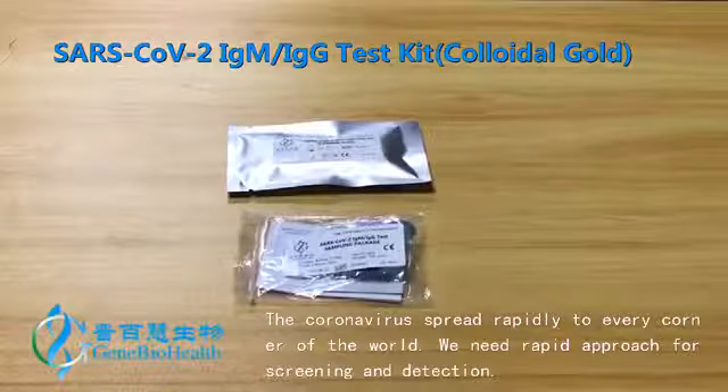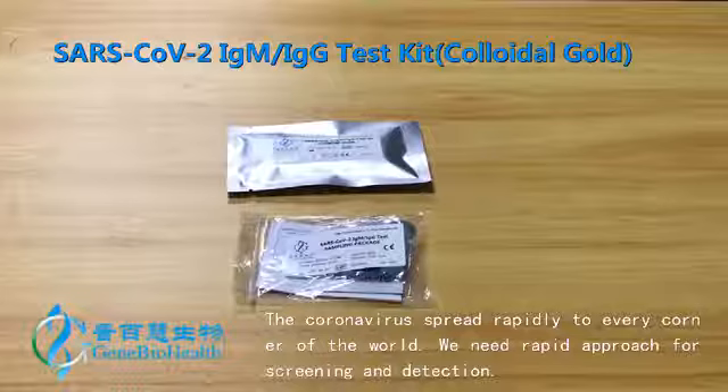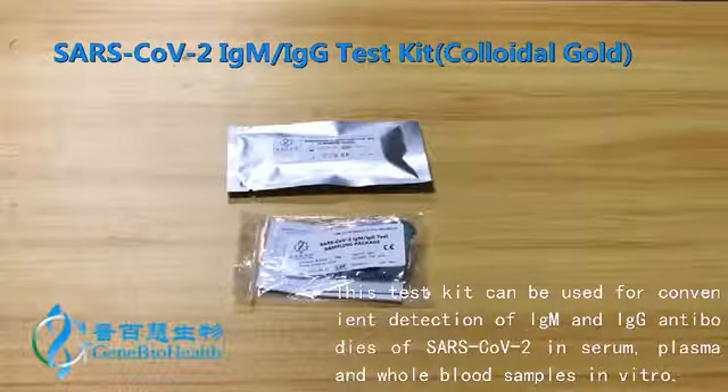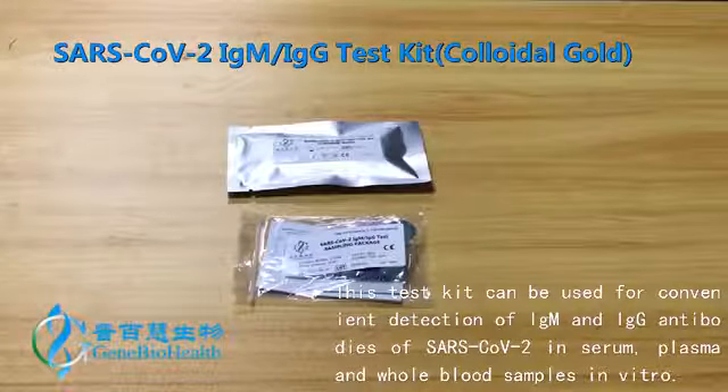The coronavirus spread rapidly to every corner of the world. We need a rapid approach for screening and detection. This test kit can be used for convenient detection of IgM and IgG antibodies of SARS-CoV-2 in serum, plasma and whole blood samples in vitro.